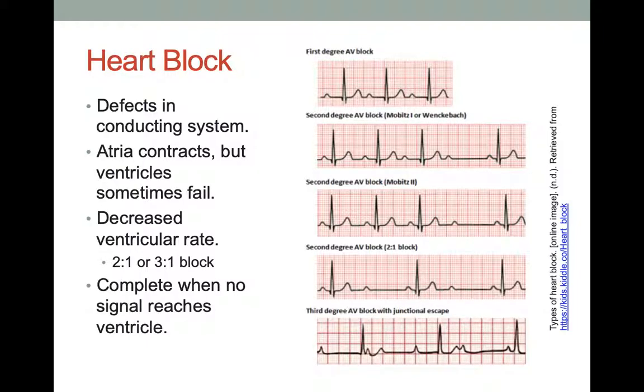If we're looking at the ECG, your P waves would seem to have a normal rhythm. The QRS and T waves also occur regularly, but there's a disconnection between them. So that could influence the way the heart's pumping and limit the effectiveness of the pump.